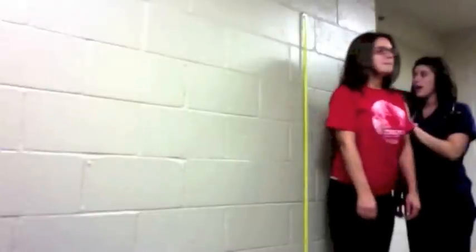You can now get up on the scale and face this way. I'm going to take your height. Okay, and step off. Thank you. 64 inches.